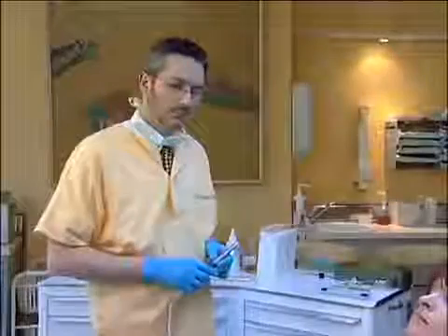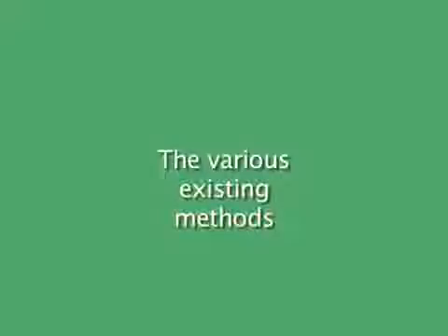Shade selection and its communication to the prosthesis lab is an act often feared by practitioners and improperly performed. The influence of the ambient light environment. The vision of color can be affected by the immediate color environment of the patient's teeth.